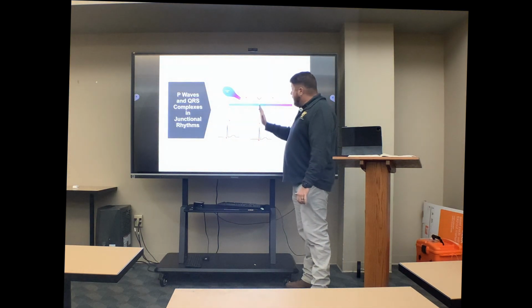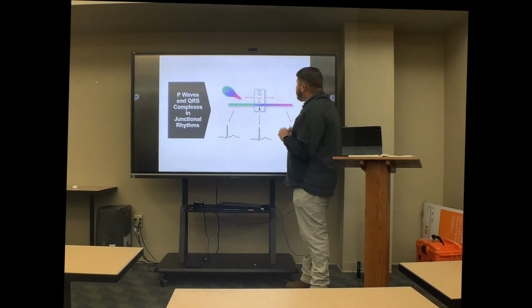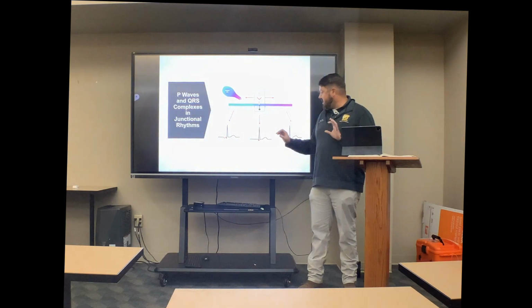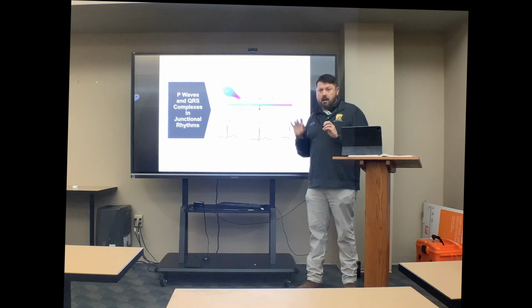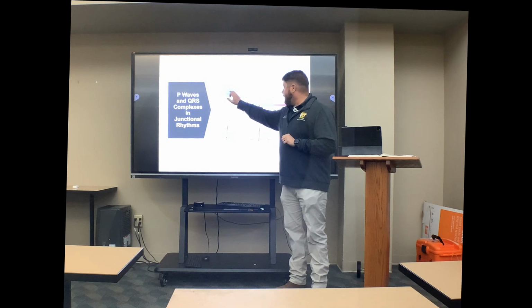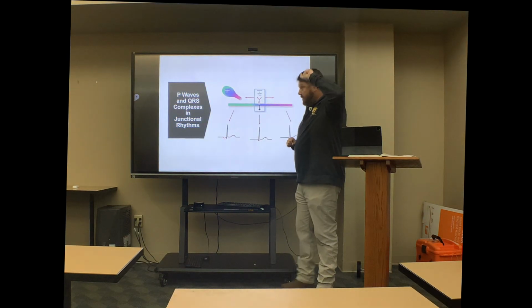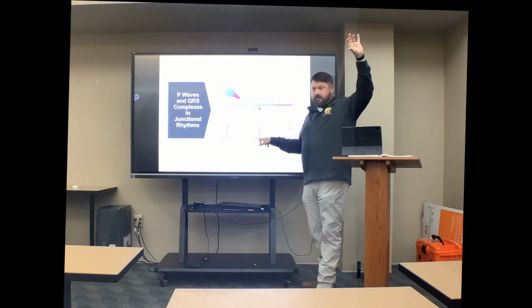If it's more in this compact zone right here, notice where your P wave's at. It's right here. Now, the only thing that it may do is you may see a little bit of a little bleb or something here, but it's not going to be enough for us to really identify, okay? Does that make sense? So what's happening is that the P wave, the site of impact is occurring right here, and it's going up, and it is retrograde conduction.